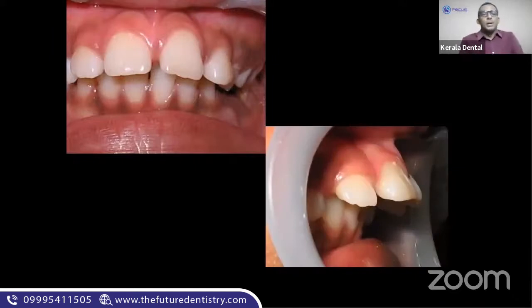Look at this picture. Guys, come to the chat box. Tell me the overjet. What do you think is the overjet according to this photograph? Come to the chat box and type in what is the overjet. I am assuming you know what is overjet. Overjet is the horizontal overlap, not the vertical. What is a normal overjet? 2 to 4 millimeter.